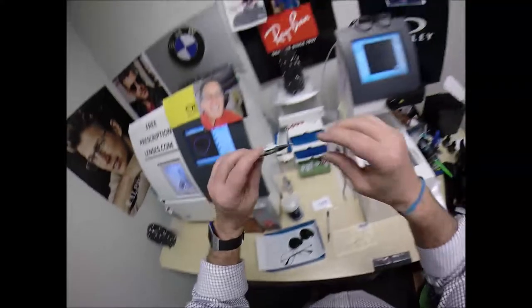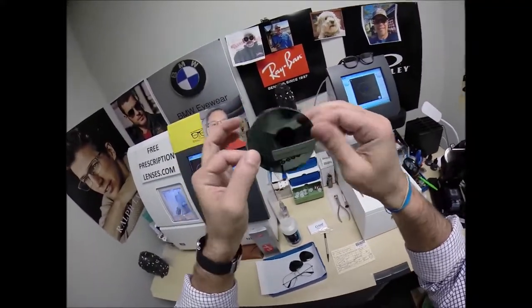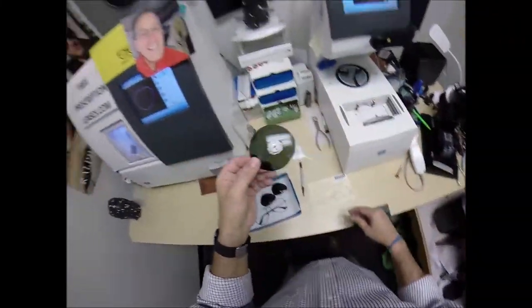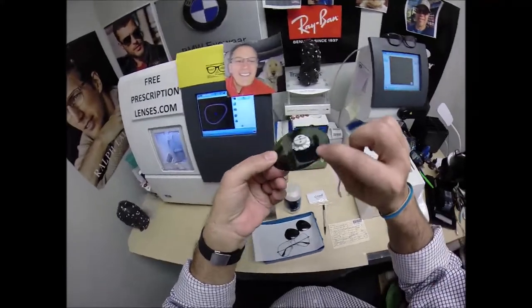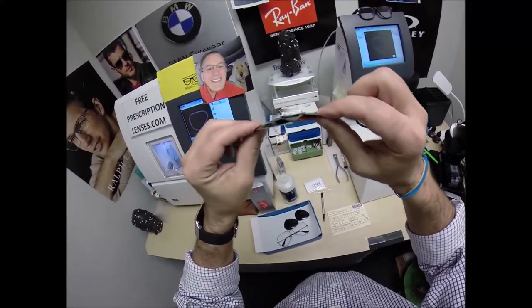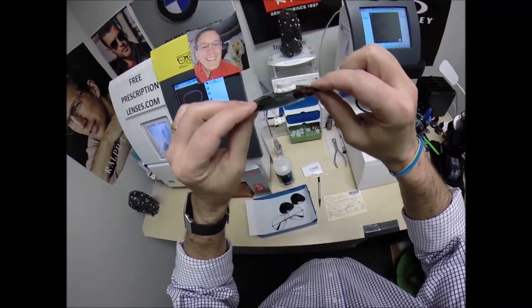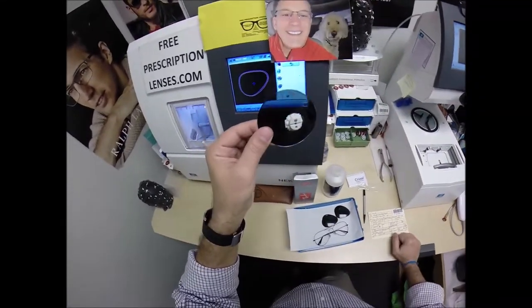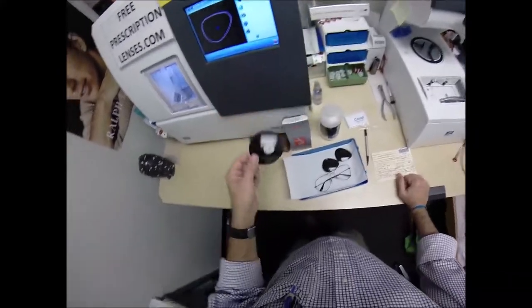So where was I at? Oh yeah, your lenses. Look how thin I got those bad boys. I did a knife edge grind thin as possible, which when you abbreviate knife edge grind thin as possible, comes out to keg tap, which sounds like something you would do back in college. But I'm doing it now on your lenses.